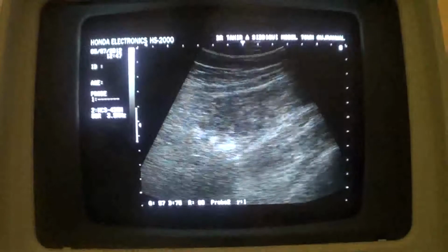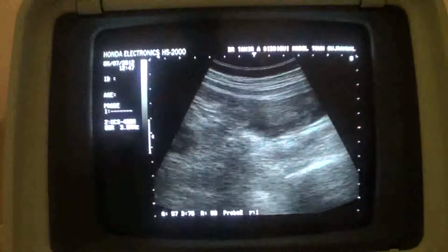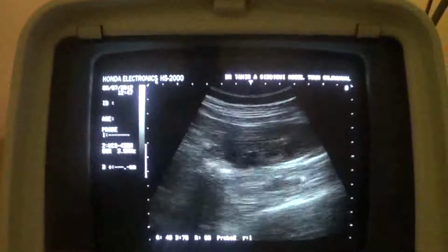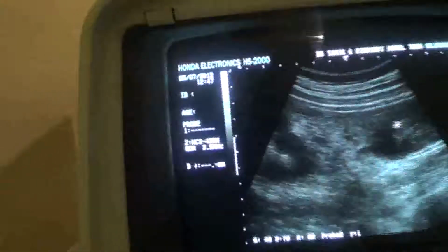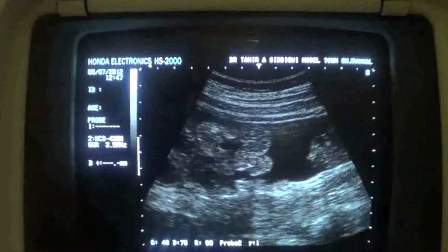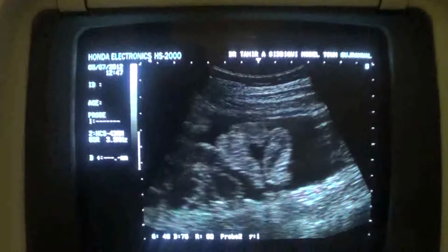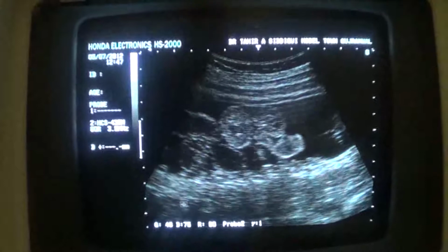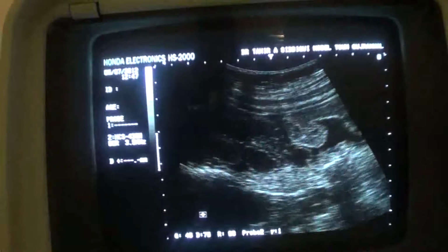So now when I move upwards, I see fluid in the right para-colic gutter. This is the left iliopsoas muscle. And you see, this is the fluid, and these are the bowels floating in this fluid. So fluid is present in the right para-colic gutter, which is bleed. Indeed.